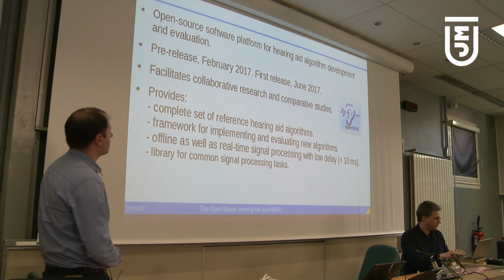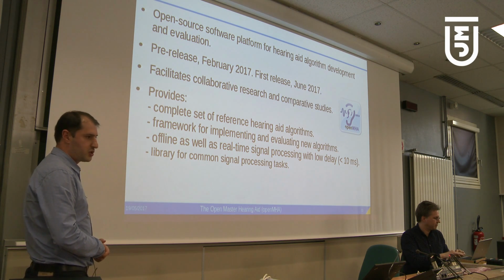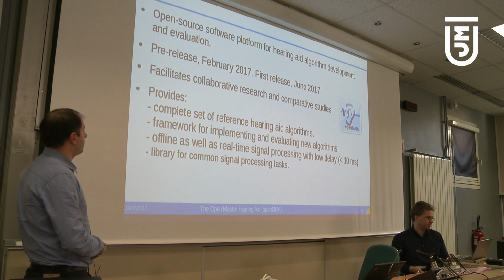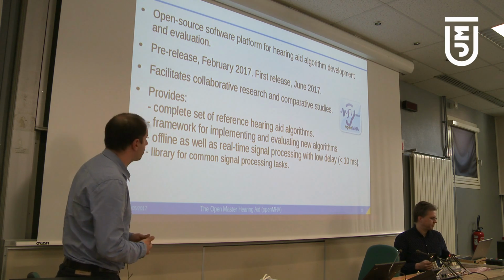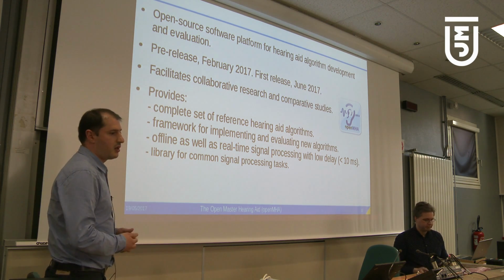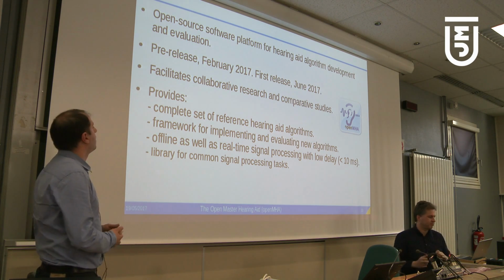So why is this platform good? Well, I hope Tobias made a good case why research in the area of hearing aids is important. But although a lot of research is done in this field, mostly it is done by manufacturers, and the accessibility to these algorithms is limited.